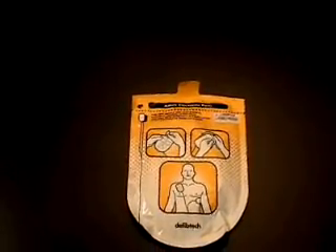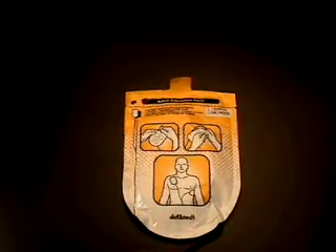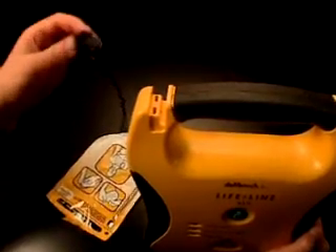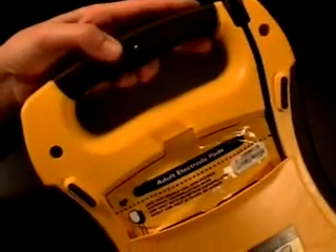The defibrillation pads are sealed in a single-use package with quick-use instructions on how to use the pads. Do not open the package until the pads are required for use. The pads are connected to the Lifeline AED using the pad connector — insert the connector into the slot in the upper corner of the unit, noting it is designed to only go in one direction. Once connected, the pad package should be stored in the holder in the back of the unit so that the pad expiration date can easily be seen. Pads past their expiration date should be replaced as soon as possible, and the pad cable should be pressed into the slot in the back of the AED.